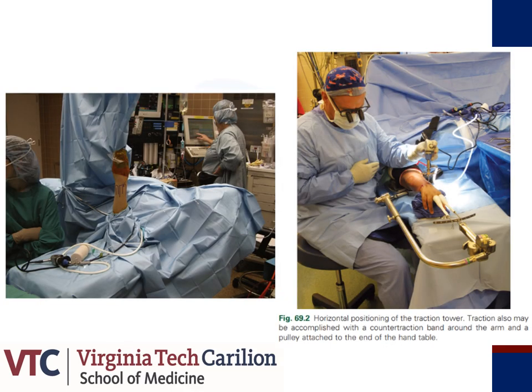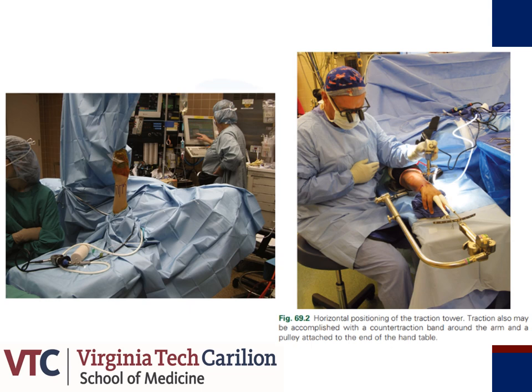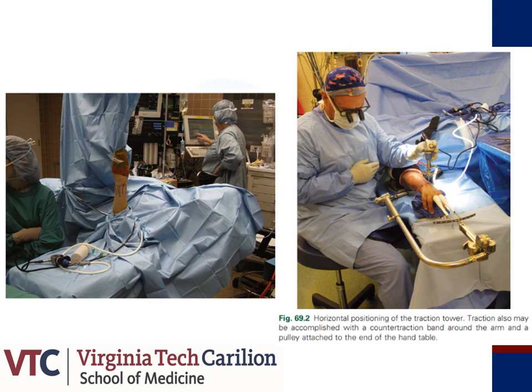Here are two depictions of available wrist arthroscopy setups. Both setups utilize axial traction through finger trap suspension. On average, there is about 10 pounds of traction utilized, though more traction can be used if necessary for a more muscular patient or when arthritis has significantly narrowed the joint space.